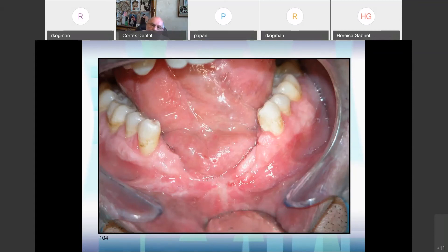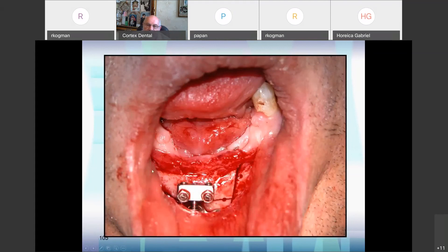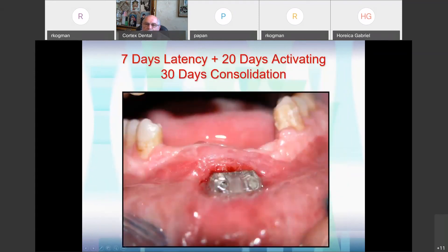So he came to me and I did my bone cuts, leaving a pedicle here. Look what I got with distraction: seven days of latency and 20 days of activation and 30 days of consolidation. Look at the crest — no problem with soft tissue cover. I have a nice cover of the area and now it is ready for implantation. We started with this, and the segment went upward 16 millimeters and forward.